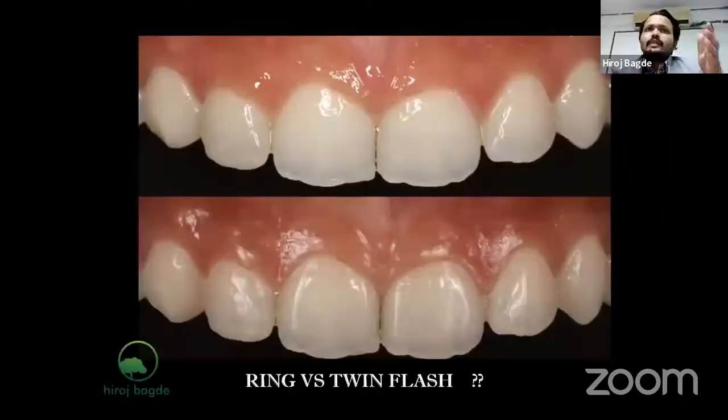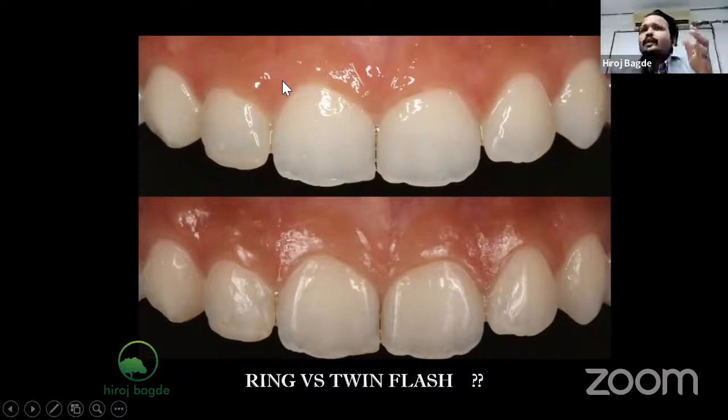Now you see both of the images. I will tell you the difference. The difference between a ring flash and a twin flash is that with the ring flash you see a harsh light as a ring over the particular tooth. But when I go for a twin flash with a diffuser, you can see the line angles very easily.